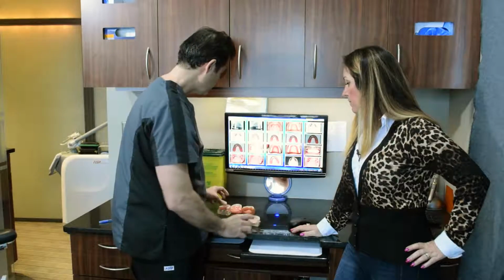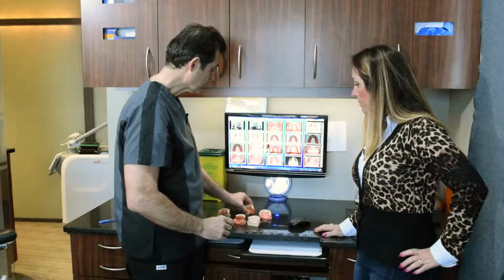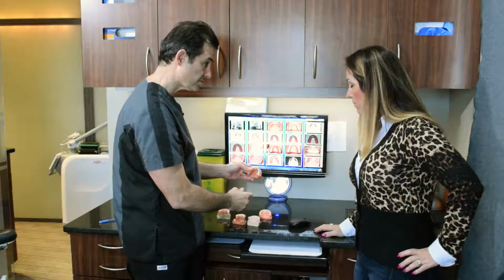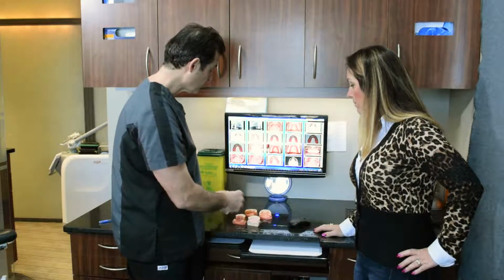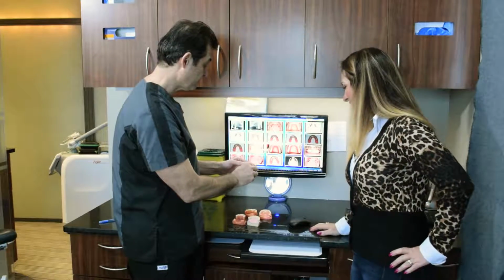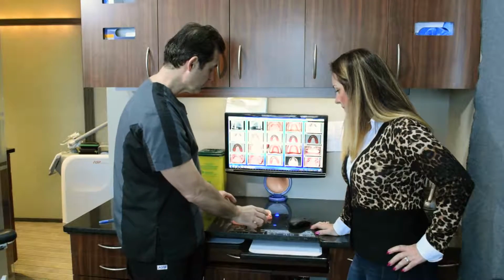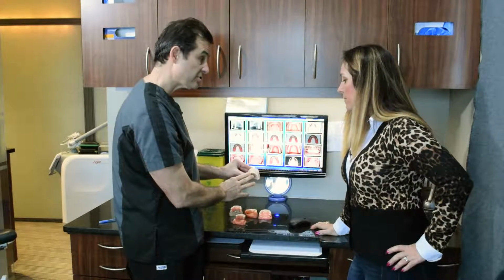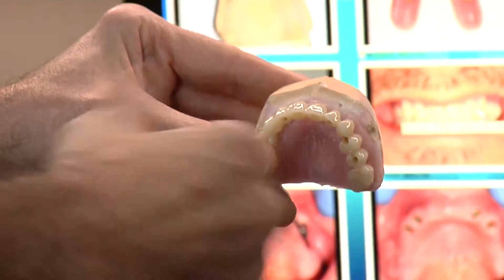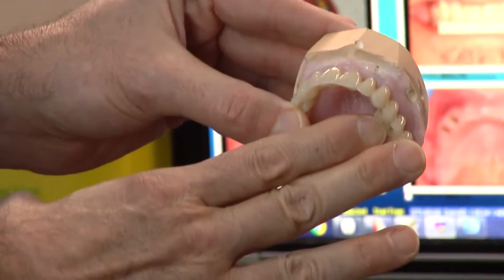Just to review again real quickly, we can do a standard denture. We can do a clip-on denture with a couple of posts, just to help hold that denture so it doesn't fall out. We can do the bar-over denture, which is the Cadillac. Highly recommended for people already wearing dentures, this is the best one. And then for people who are losing their teeth, we can do a fixed bridge. This is really the nicest thing that you could do. No dentures, nothing is being removed. Easy to clean, easy to maintain. This is an excellent procedure.